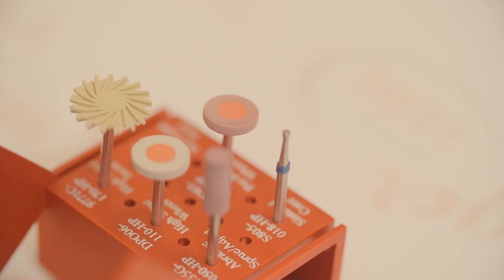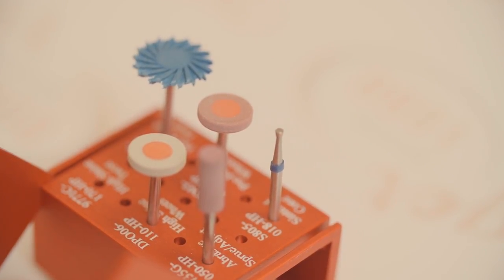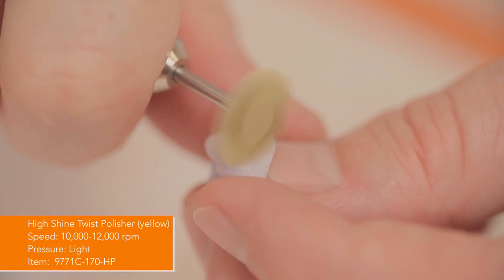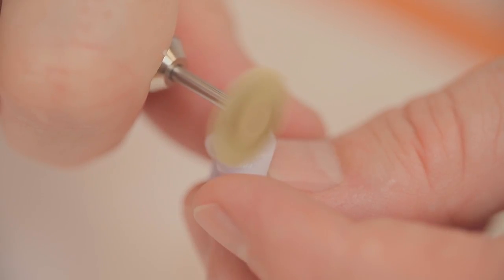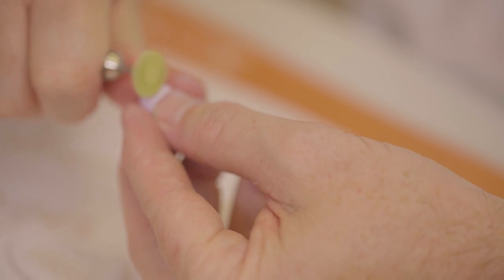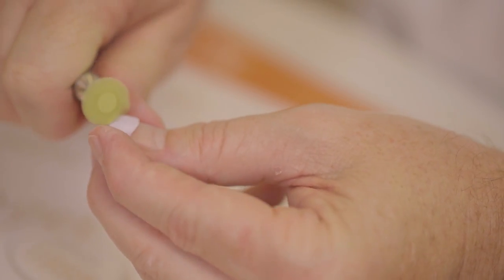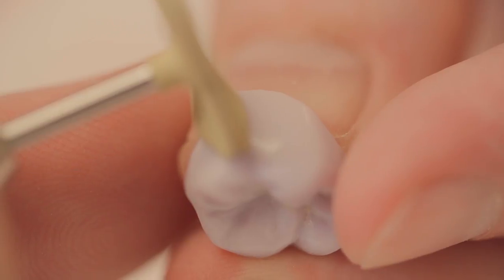The final step that we're going to do here is we're going to go to our high polish twist wheel, which is yellow in color. We're going to run this about 10,000 RPM, and this is going to be light pressure. Light pressure is going to do all the work for you, and we're going to get a very, very nice glossy finish on here. And I'm not going to be bouncing all over the place. You can actually go sideways like this if you'd like, but I tend to just go up and down to my margin here. I'm going to let this wheel work for me. You can already see that we have an incredible gloss finish on here from this wheel.